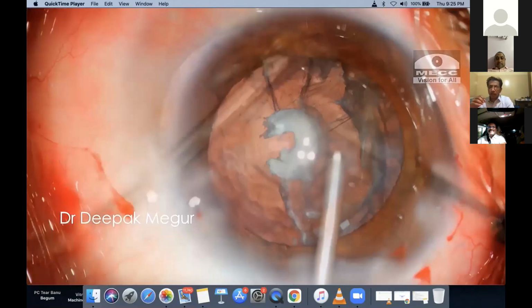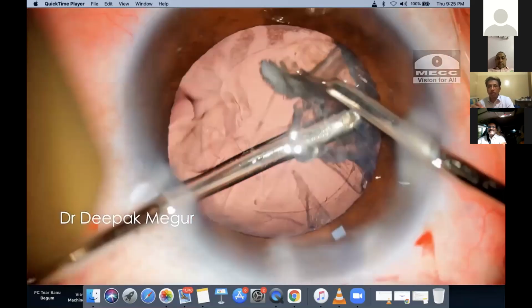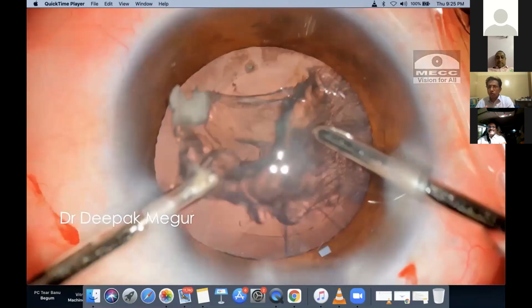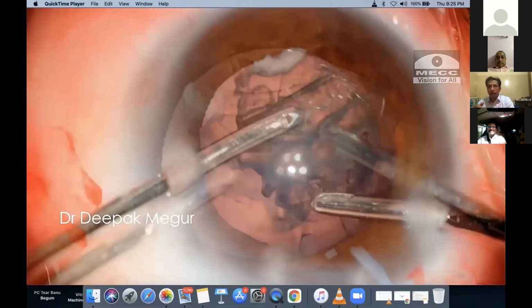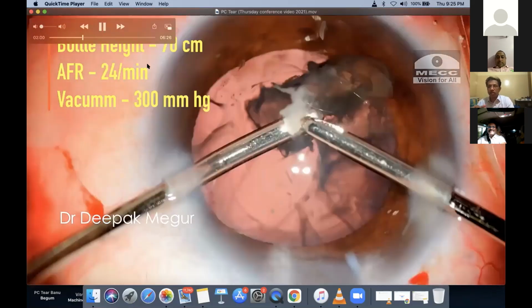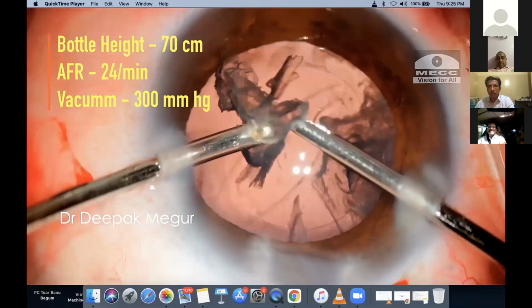I think the only secret to achieve this is you need to give a lot of time. There is no hurry. You've got all the time in the world here. You may have another 10 cases waiting for you, but this case deserves every bit of attention and time. Skill is not so much required. You just have to develop the right attitude. And the bottle height is dynamic. As soon as you see that the chamber is slightly fluttering and shallowing, you can always ask your assistant to increase it a little bit.